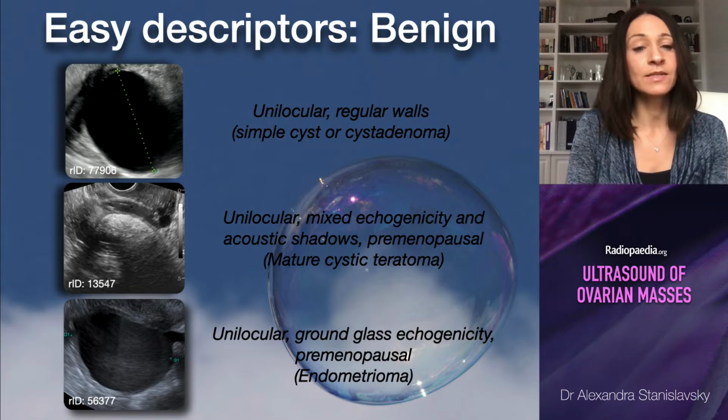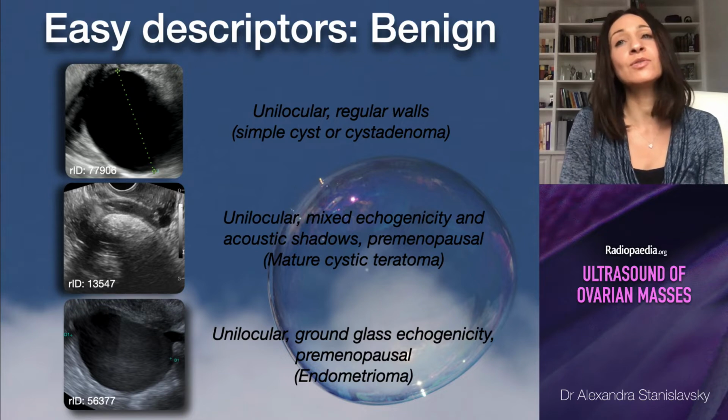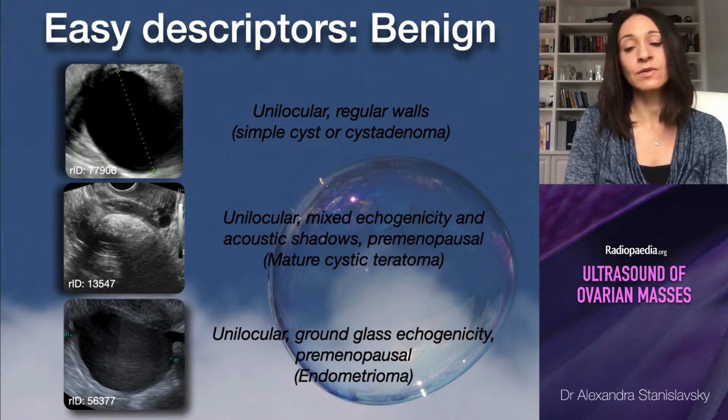If any of these are present, it's sort of a gestalt diagnostic appearance. You don't need to go through the definitions of the simple rules.